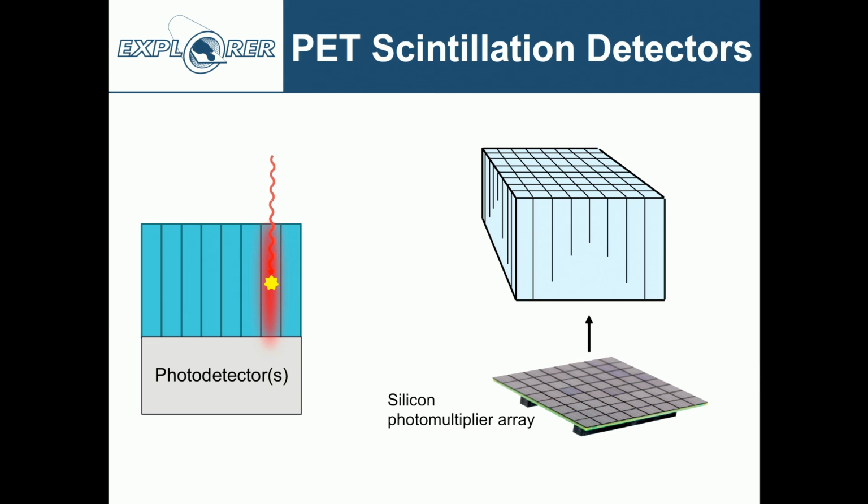Increasingly today, we're moving towards solid-state detectors for the readout of the scintillator array. So devices such as silicon photomultipliers shown here, very compact form factor, but a large number of channels, as you can see, that need to be read out. So that's the classical approach.